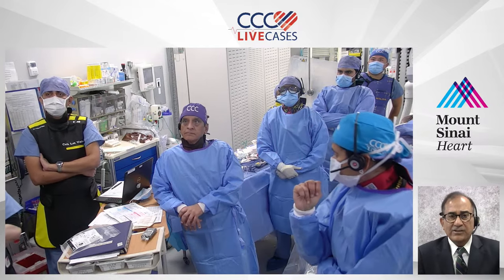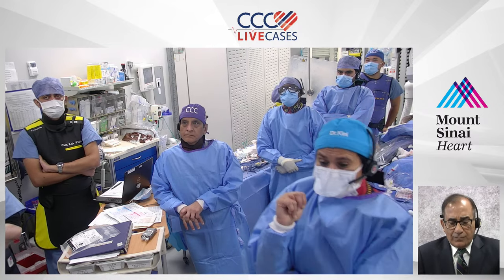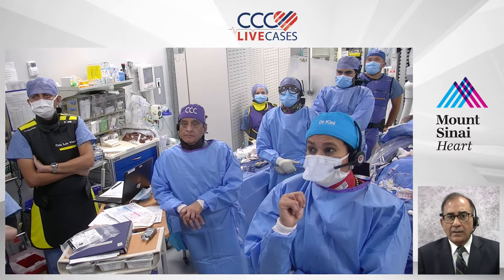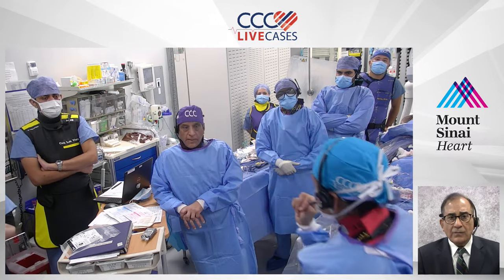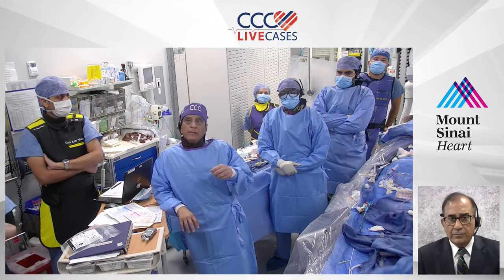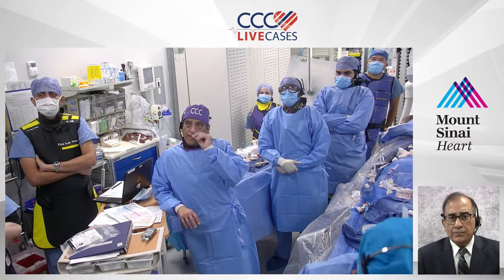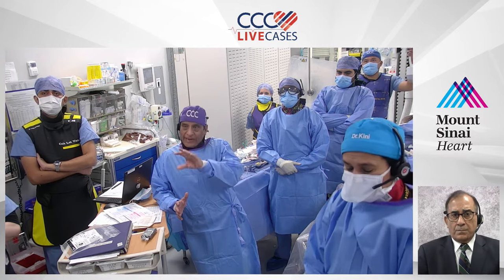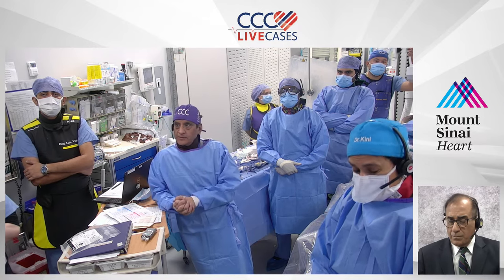Anu, you had some comments, I can see. No, the total contrast use was 150 and the air kerma was 1.6 in this case. And the real answer will be the YELLOW trial. Yeah, but genetic analysis is going to happen. Now coming back to the FORZA trial, there are trials that have compared IVUS versus FFR guided intervention, and there was no difference in the outcomes.